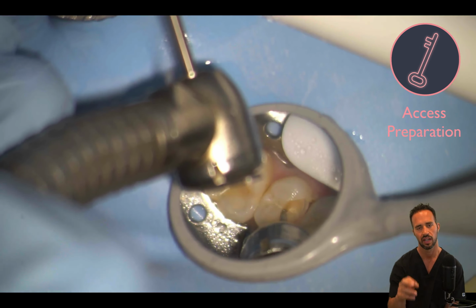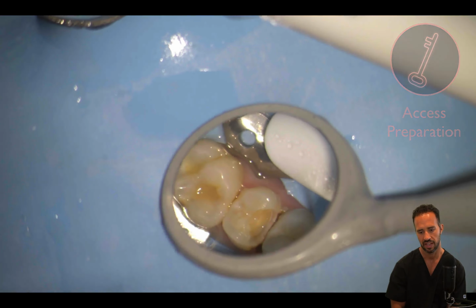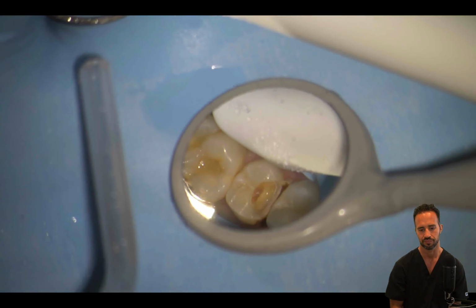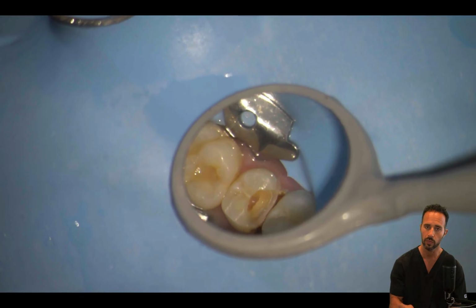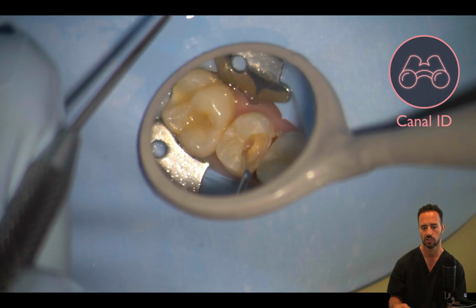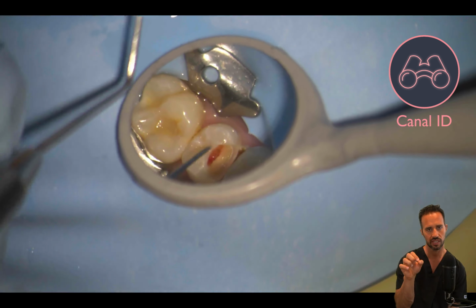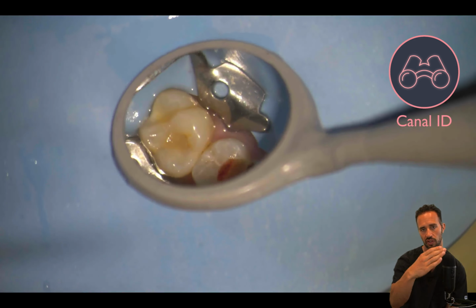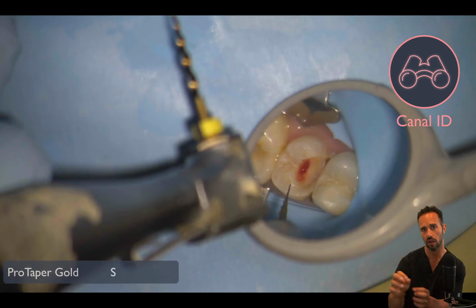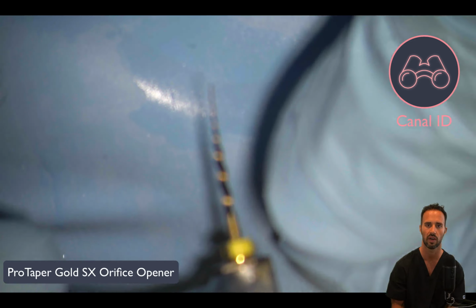So I'm using a number 4 high-speed surgical length round burr here just to gain entry into the pulp space, and I can get right in there. Now, we know that there's 2 canals present already in this case, okay? But if we didn't, it's going to be important that when we find that first canal, we appreciate that it's not centered in the tooth. So when you use your Endo Explorer like this and you're getting into the canals, if you're into a single canal that's centered along the central fossa of the tooth, okay, it's a 1 canal case. If the canal that you initially find is off center, either buccally or lingually, that's another way you're going to be able to determine clinically that there's more than 1 canal.